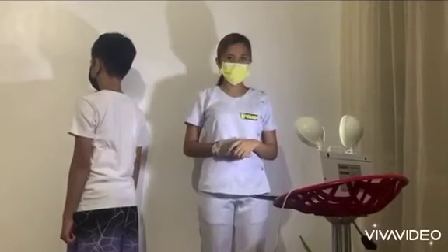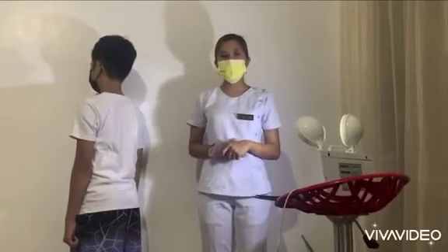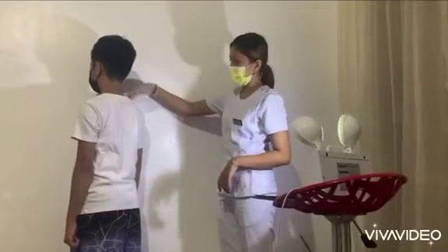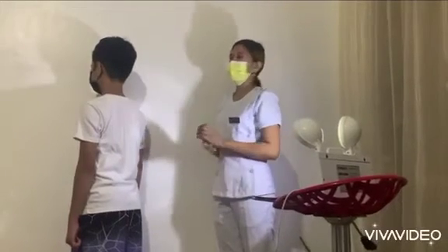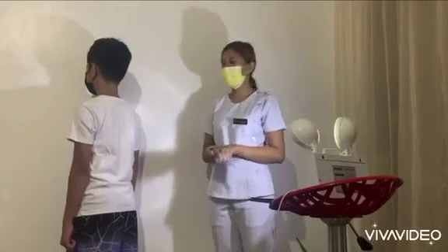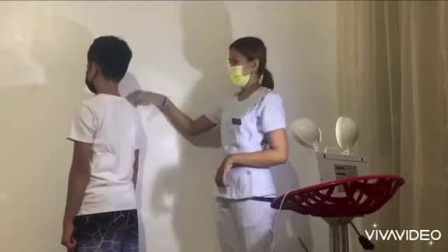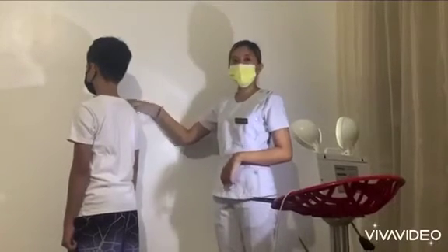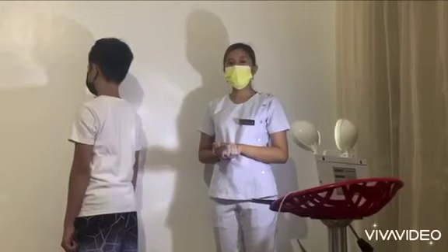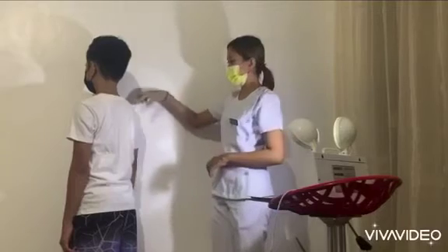Another thing you can do is use the superior angle of the scapula to check and make sure you have it lateral. If the superior angle and this AC joint line up and make a line, then you're going to get your scapular Y. So this is the reason they call this a scapular Y.